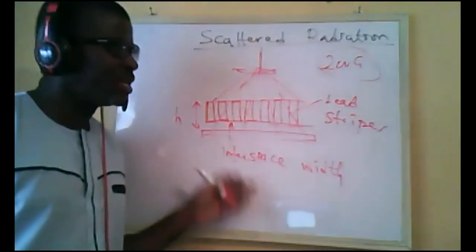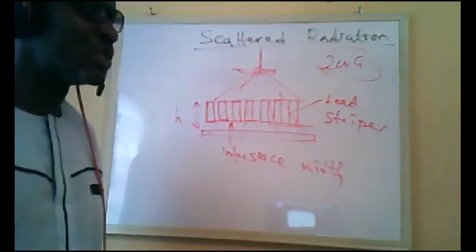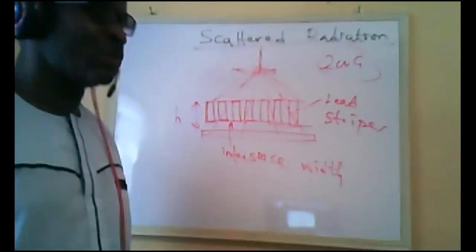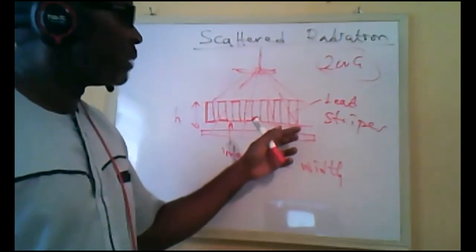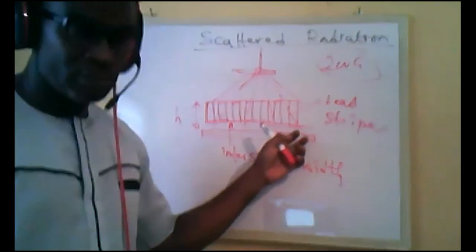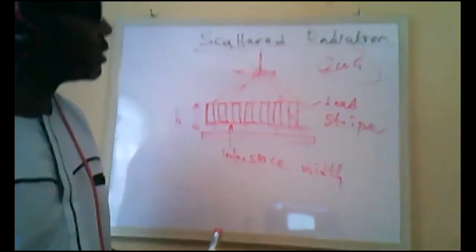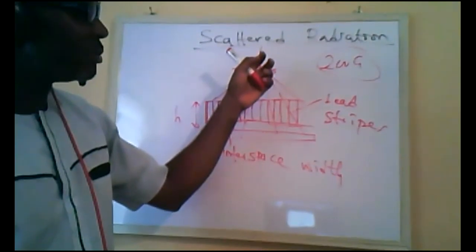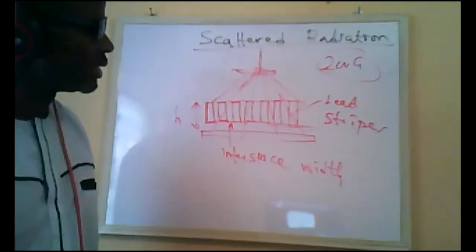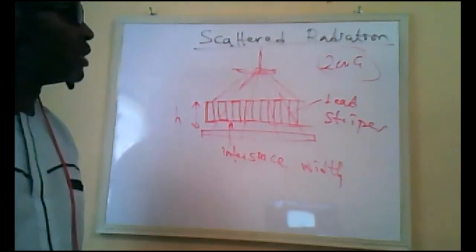So the grid is there. The presence of a grid increases the dose the patient is going to receive because of the rejection of so many scattered photons, which would have ordinarily been incident on the receptor, but wouldn't yield any image, due to the event happening at a scattered distance. But in the end, it helps us with good image quality.